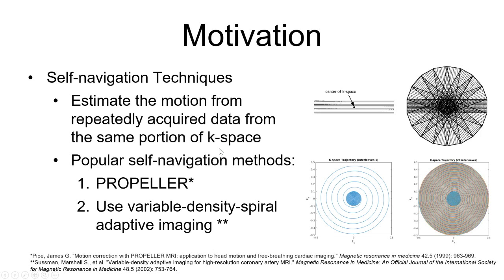A center-out imaging method, spiral MRI also has a natural advantage of rapidly oversampling the center of k-space. An example of one VDS interleave and a stack of 20 interleaves are shown in the figure on the right. Each interleave consists of a variable density spiral designed to have higher inner spiral density and lower outer spiral density.